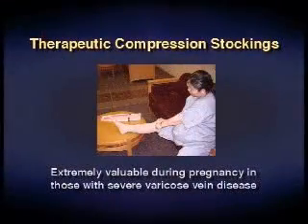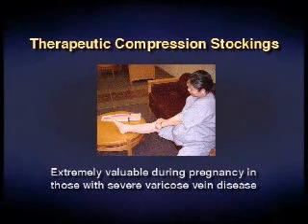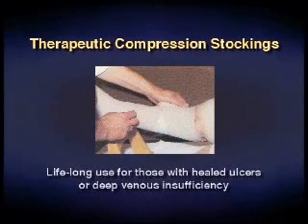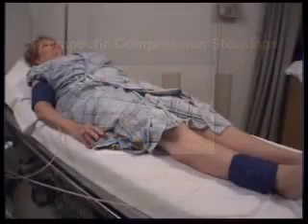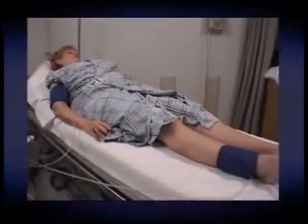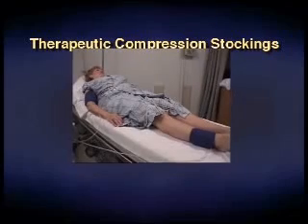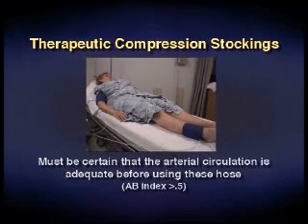Extremely valuable during pregnancy in those with severe varicose vein disease, and also used lifelong for those with healed ulcers or deep venous insufficiency. One must be certain that the arterial circulation is adequate before using these hose, and a careful physical examination, including an ankle brachial index of greater than 0.5, should be documented.